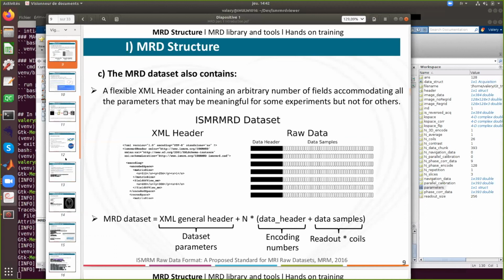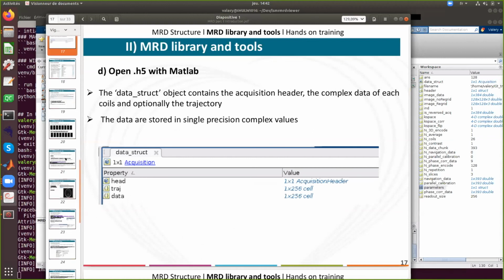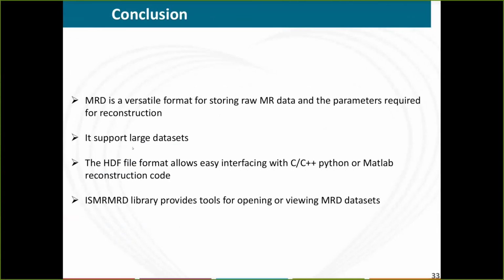So to conclude, I want to say that the MRD dataset is a versatile format for storing raw MR data and the associated parameters required for reconstruction.